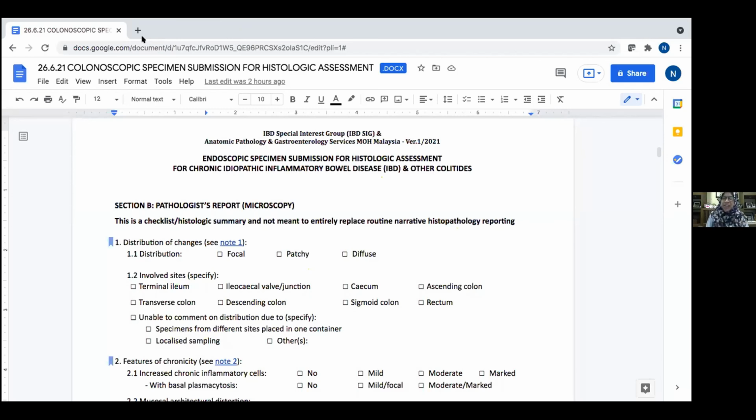But in deciding whether it's truly thickened, you must make sure the orientation of the surface epithelium is correct. It's really perpendicular, a single cell layer, not tangential, and there's no retraction artifact of the subepithelial lamina propria. The orientation of tissue is very, very important.